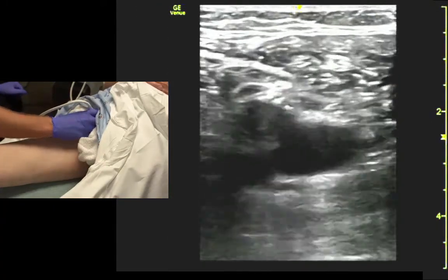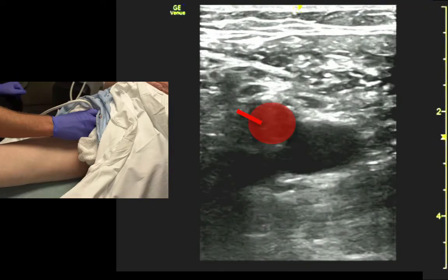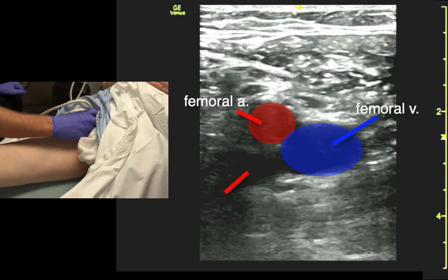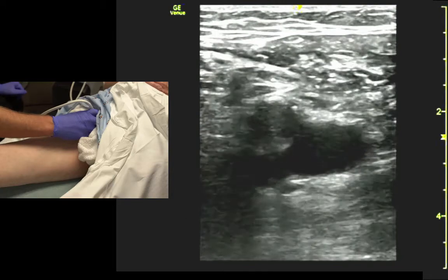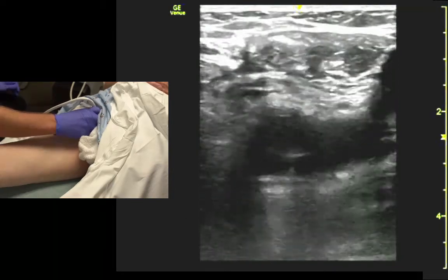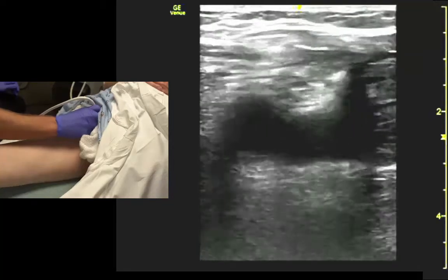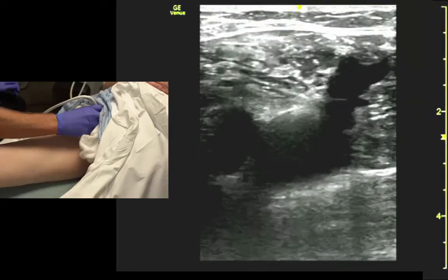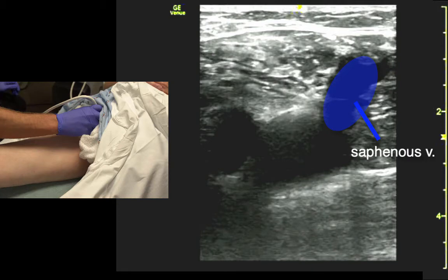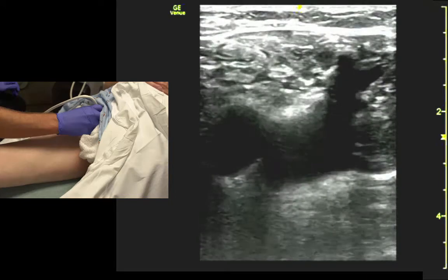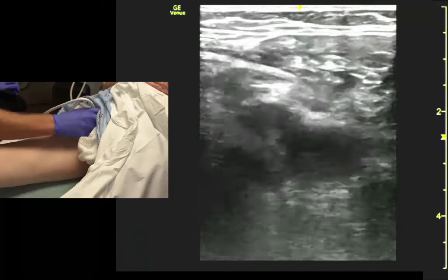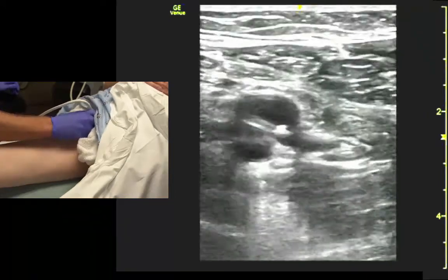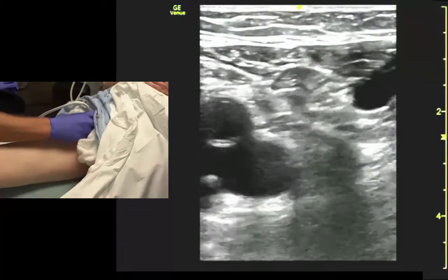When we first find the vessels, we see the artery and the vein — the vein's medial. If we track proximally, we should see the saphenous vein as it joins in the femoral vein. The vein should collapse, and the artery resists compression.